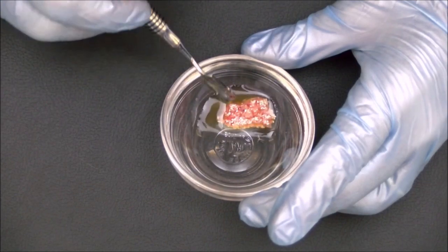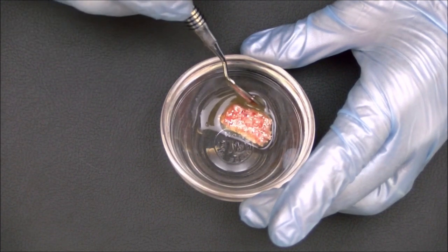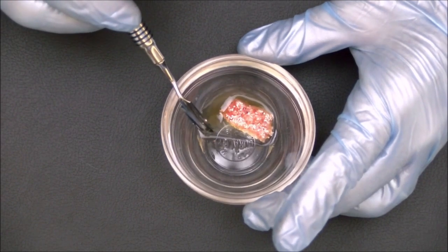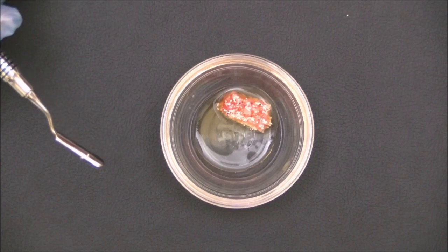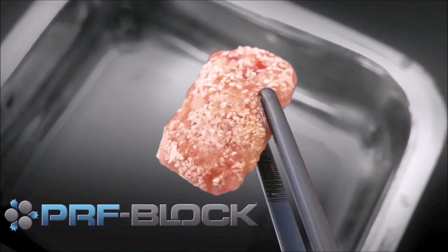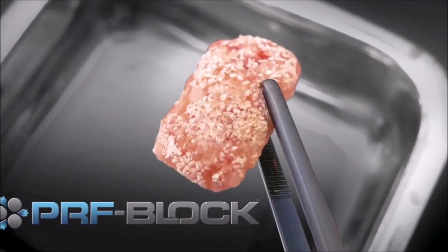If desired, the bone graft can be placed directly on the defect site, and then coagulated in place through the final shape using the plasma syringe. The result is a PRF block, which is dense, durable, and can be held in place by bone screws.